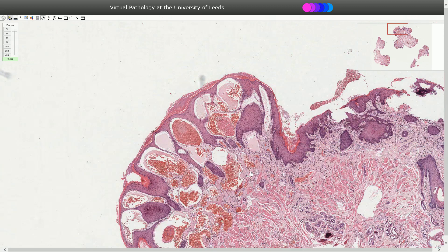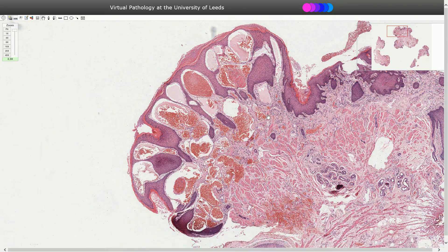Angiokeratoma should be localized in the superficial portion of the dermis. We should not see proliferation of blood vessels in the deep dermis.